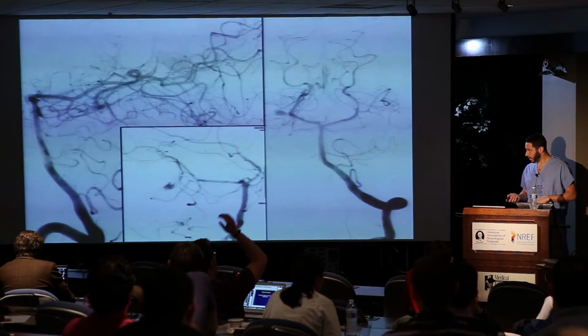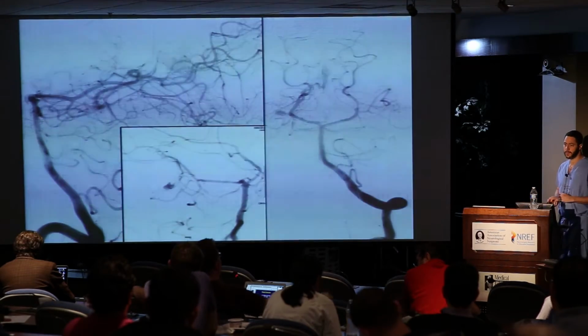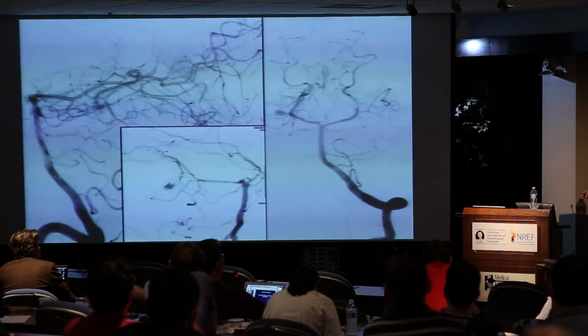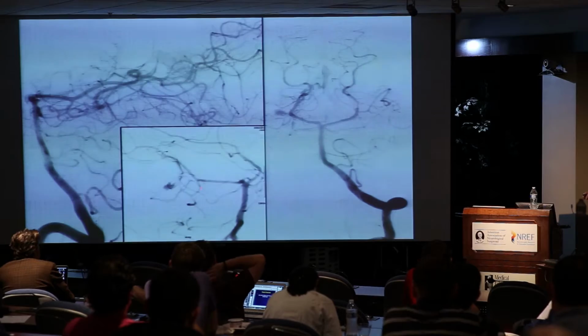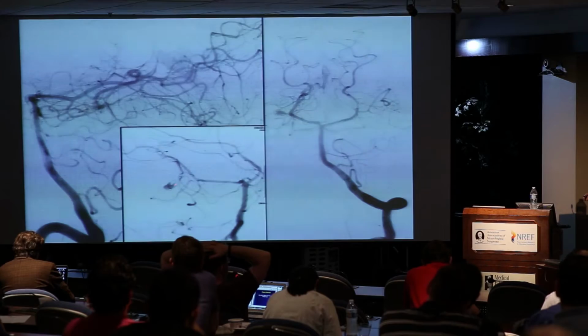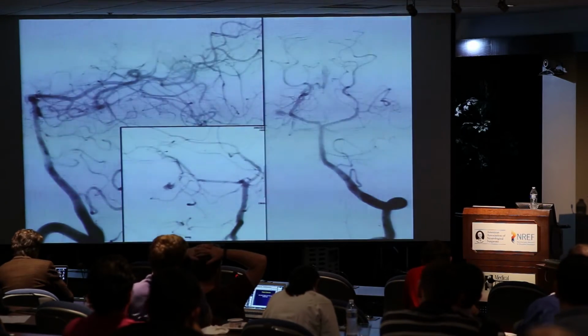Okay. So, I have a question. Have you taken to using the Apollo? Is it working well for you? My only case was compassionate use, for this case. This is before it was out commercially. And the reason to use it in this case, I told you I hate pulling Marathon microcatheters, and I was looking at this bend where I just didn't want that traction. I didn't know how on top of the nidus I could be with my microcatheter. So, you can plug and push, but then if you travel a long segment, I just didn't, and I'll show you the detachment.